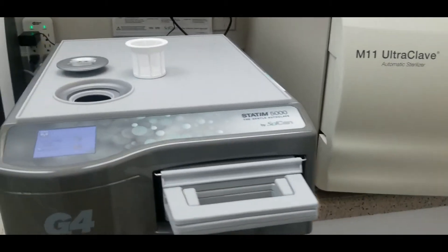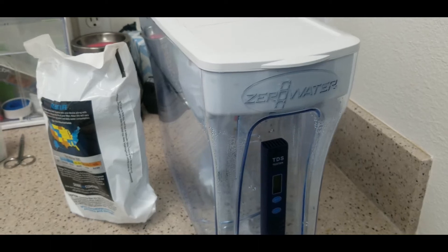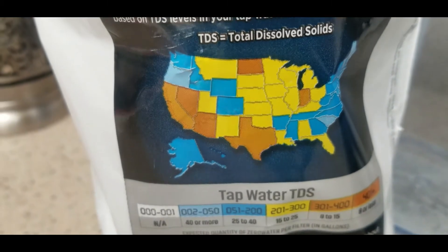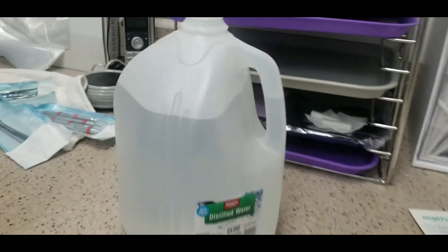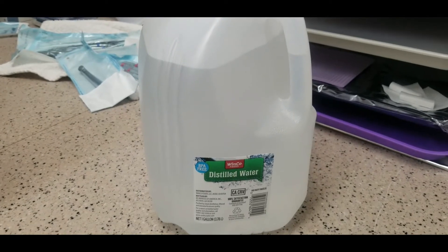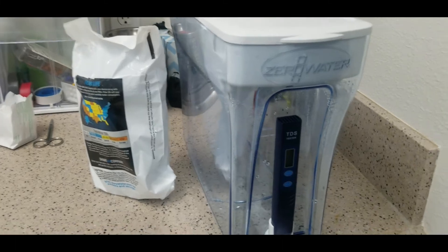For any autoclave like the M11, you want distilled water at a TDS level of zero. I think the zero water filtration system is a great backup, but not the primary source of distilled water because of filter expense. If you live in an area with really soft water it may make more economic sense, but I still like having it as a backup since we had a hard time finding commercial distilled water. There are also fancier filtration systems and water distillers available.